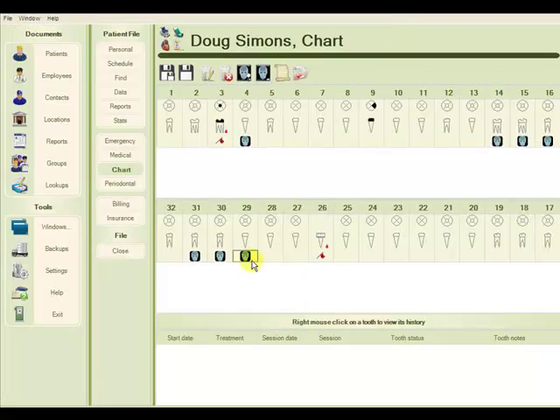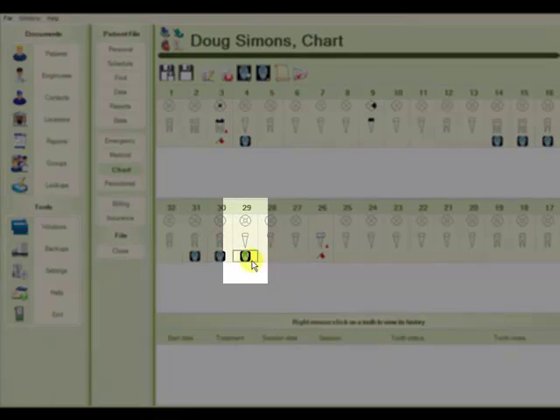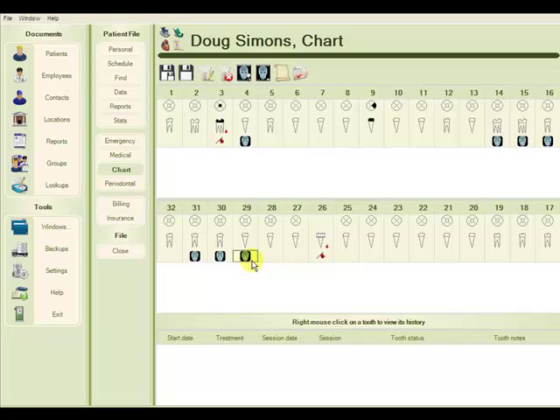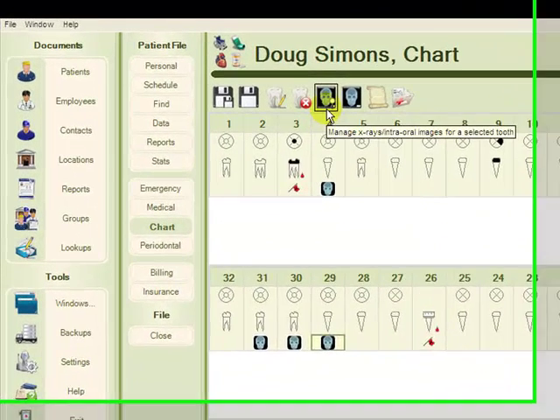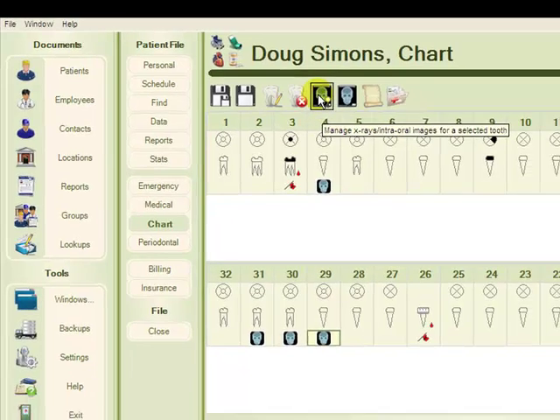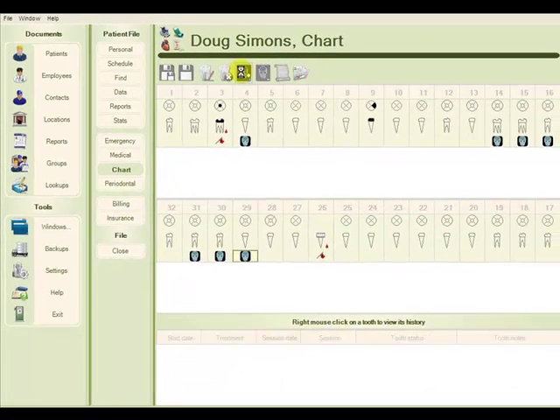So we'll choose tooth number 29, which is the one we wanted to unlink the X-ray from. And this time we'll choose to manage the intraoral images for a selected tooth.